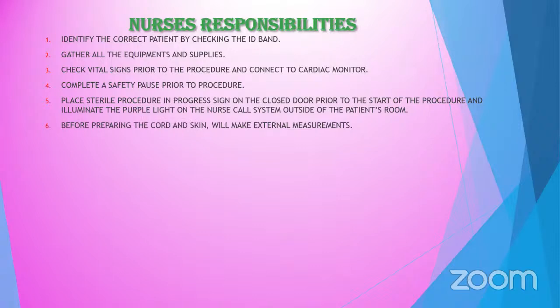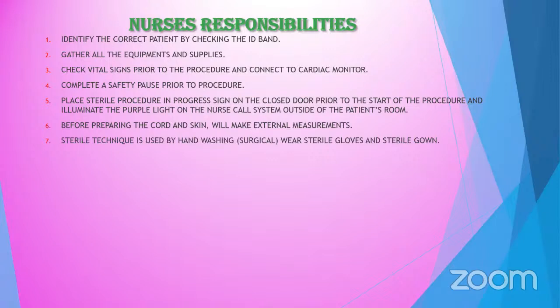And then sixth, before preparing the cord and skin, we will make an external measurement. This is where we measure the length of the UAC and UVC. And then sterile technique is used by hand washing. It should be surgical hand washing for 1 to 3 minutes, like we do in the OT, and then wear sterile gloves and sterile gown. And this is important, make sure everyone present during the procedure wears a cap and a mask.